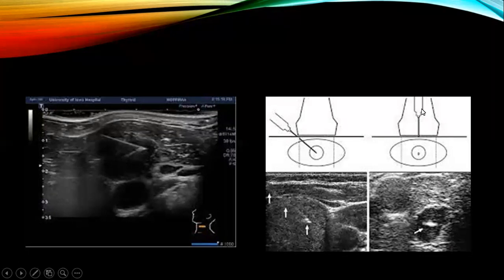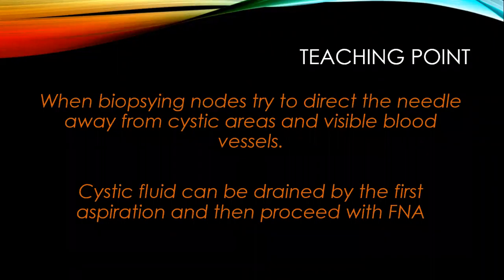On the perpendicular technique, because we are directly on top of the nodule, on ultrasound we are now going to see only the tip of the needle in the nodule. So this is our nodule. This is the tip of the needle.